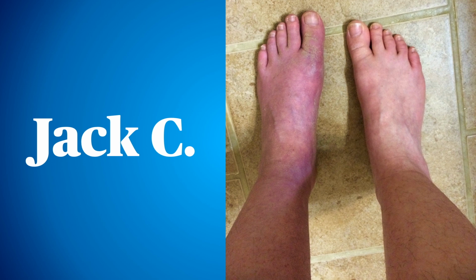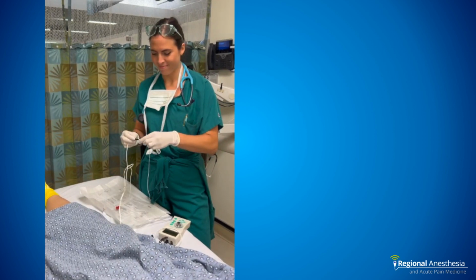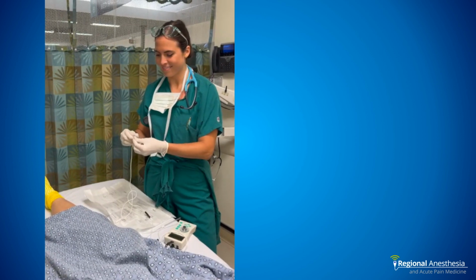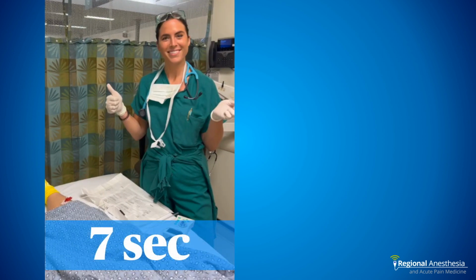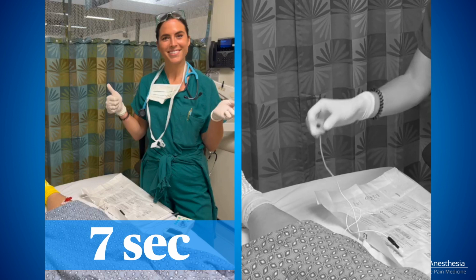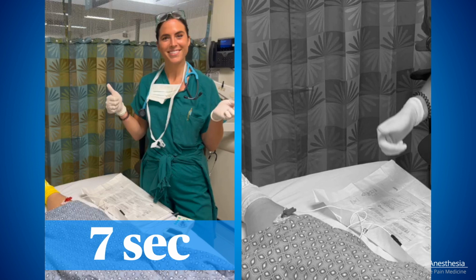And I get pushback sometimes saying, ugh, Jeff, what a hassle, putting the nerve stimulator on, pulling in an extra bit of equipment. I want to show you. And for those of you who have never used a nerve stimulator before, this is an instructional video. So here we go. We connect the wire, we take the sticker, and we put it on the patient. I know there was a lot going on there, so I'm going to slow that down. Here's the sticker. She takes the backing off the sticker, and she puts it on the patient. You know, it's not that hard.